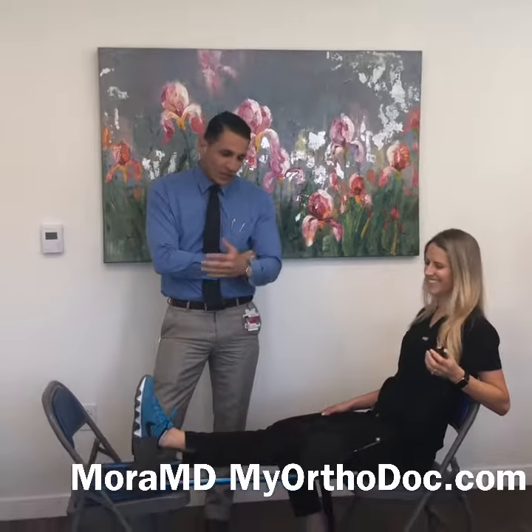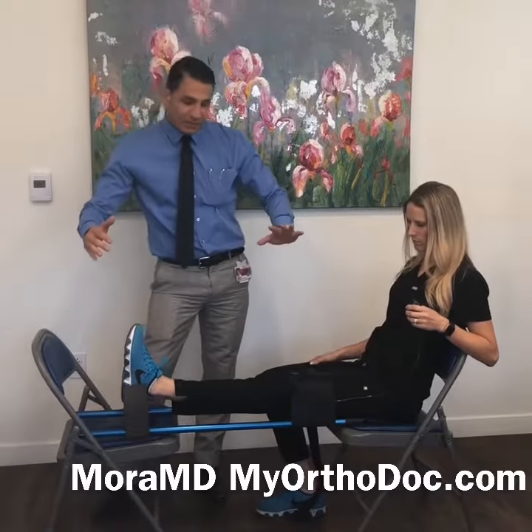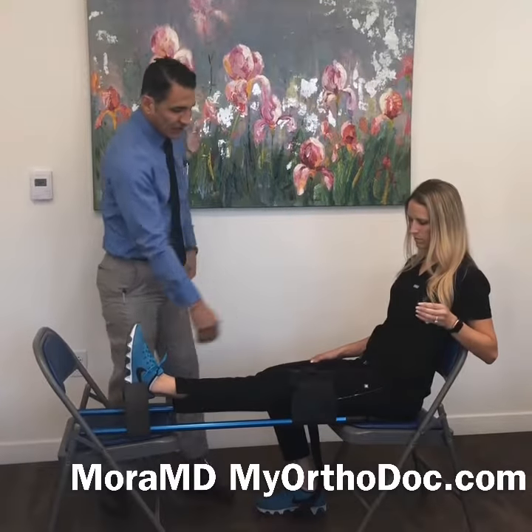So then I met Kelly and she told me about her extensionator machine. I like to call it the extensionator. The extensionator is very cool, very easy to use. You put it up between two chairs like this, or just on your bed. Kelly, why don't you show us what it does.